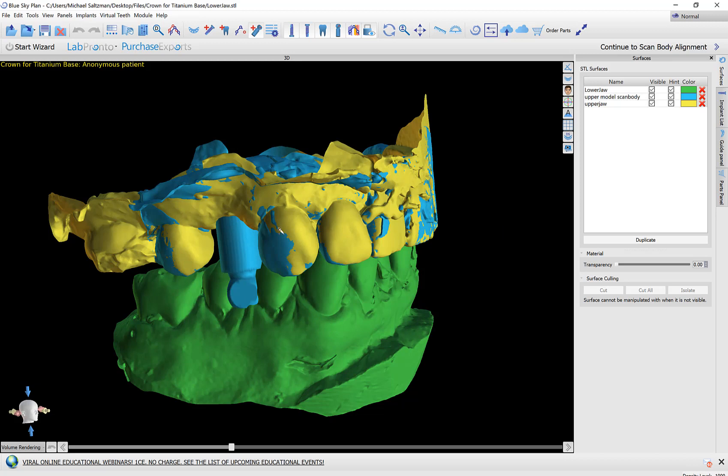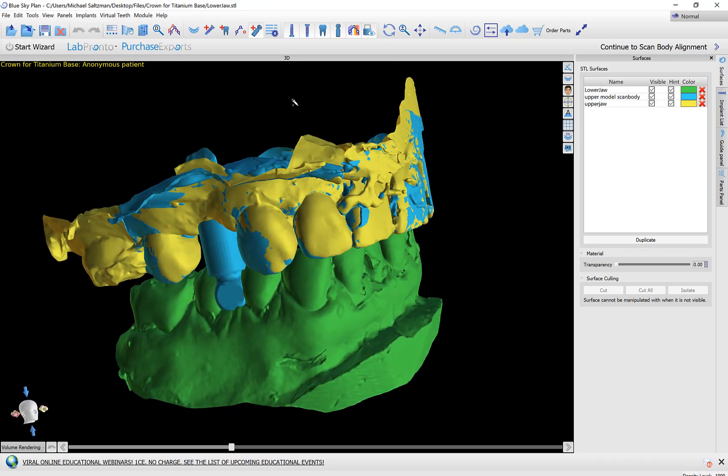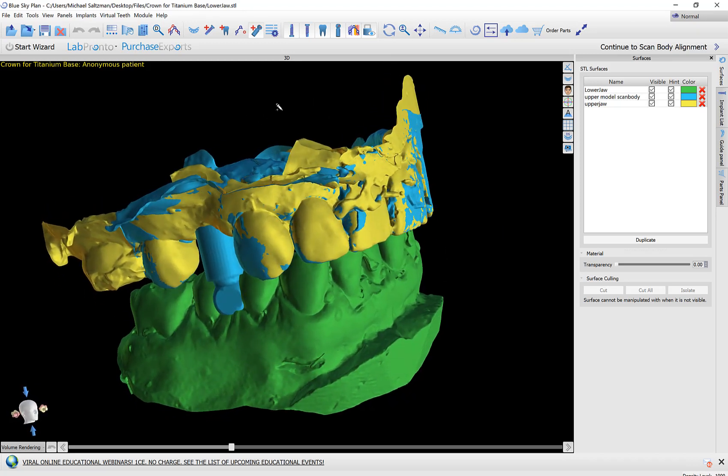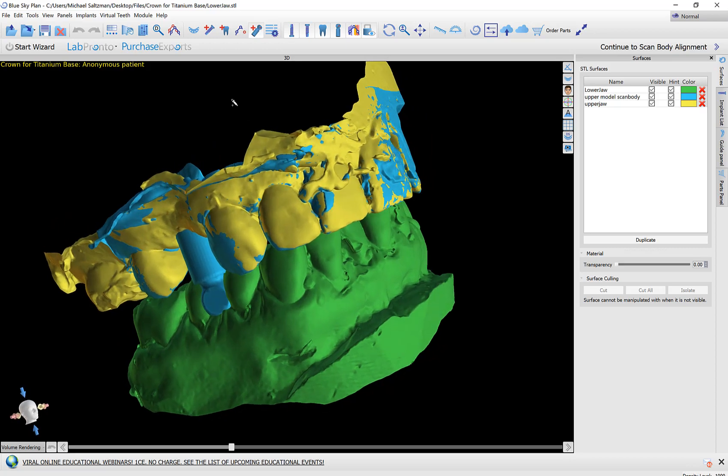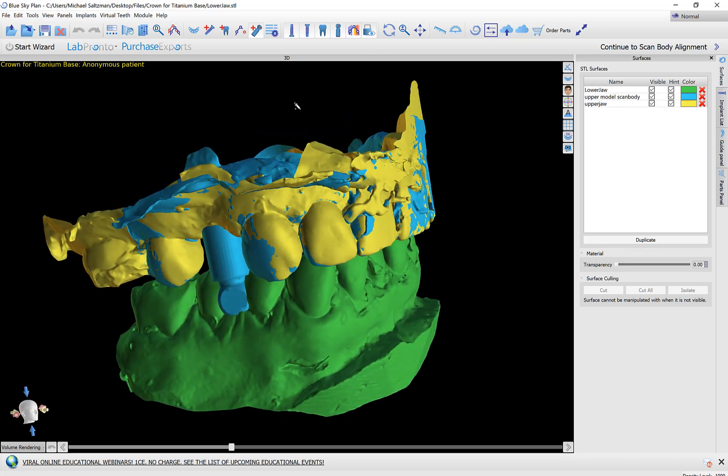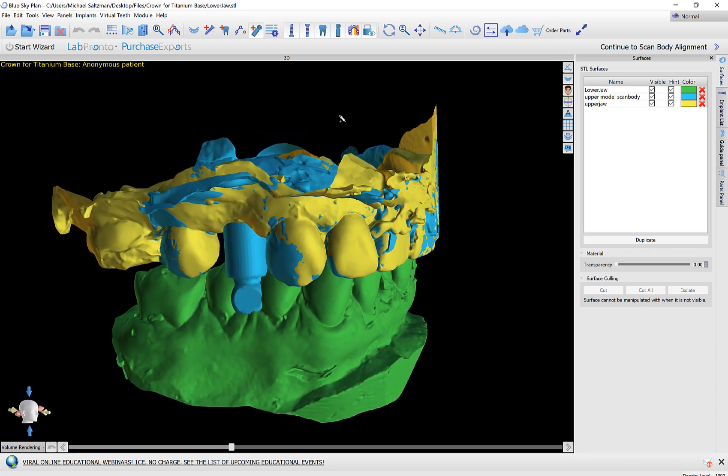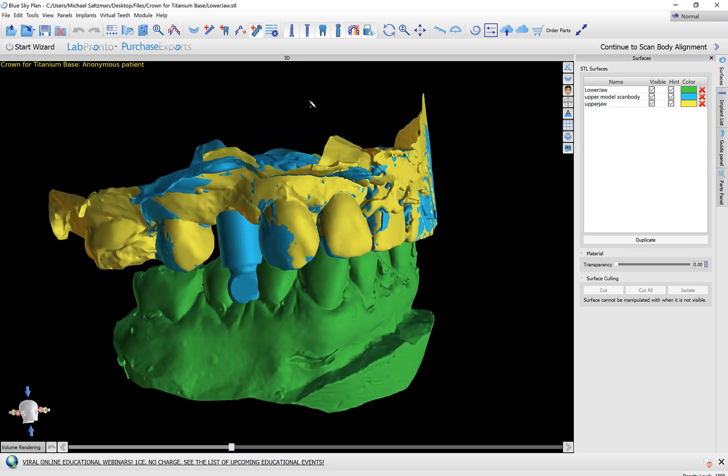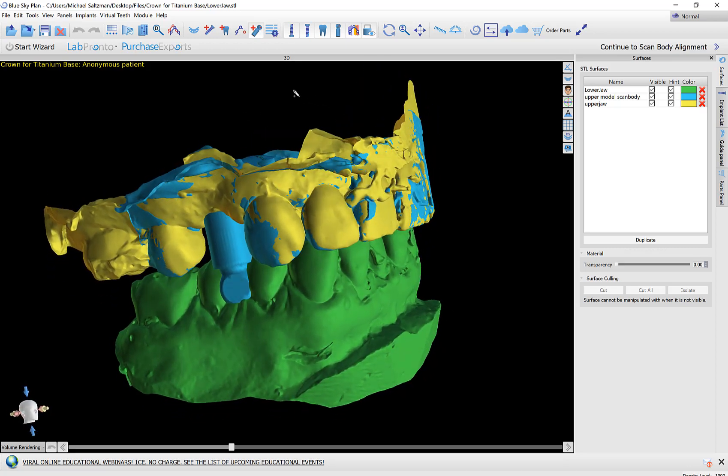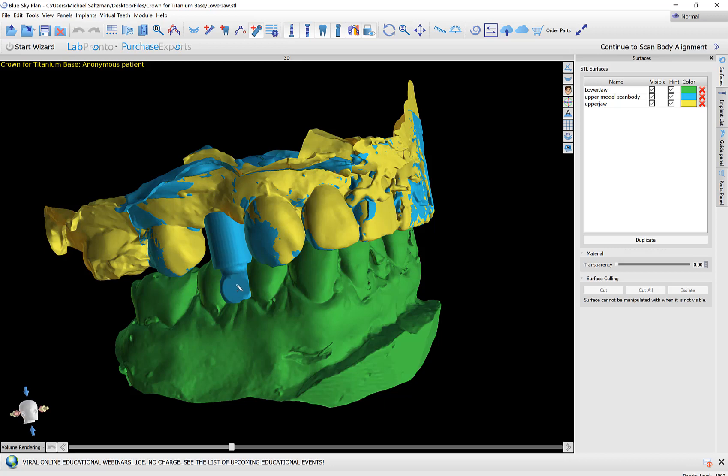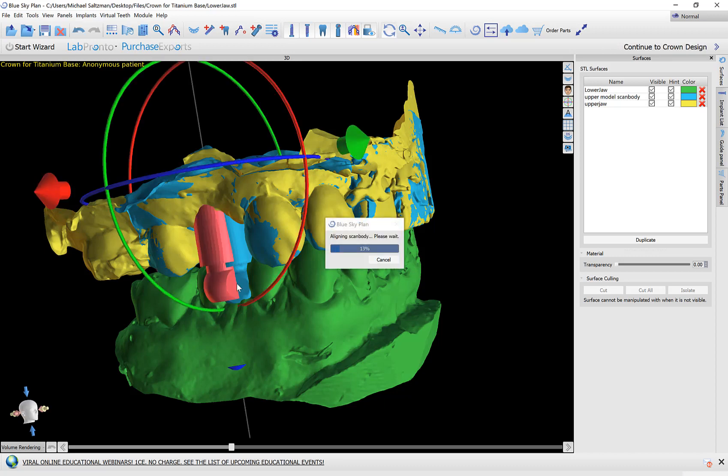If I do need to rotate the models I could use my left mouse button to click outside of the models and rotate and orient. If I click on the model then it will try to align the scan body to the point that I clicked. At this point I see the scan body and the flat section of it. I'm going to align my crosshairs to the middle of the flat part and left click once. The software is going to process and align the scan body.